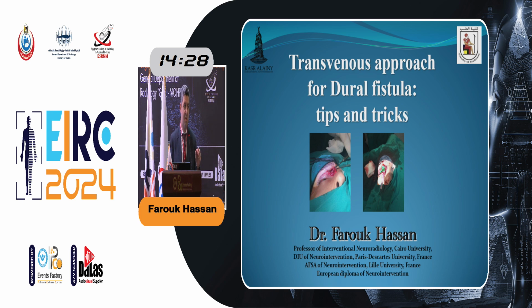We will be talking about the transvenous approach for dural fistula. We'll be talking about some tips and tricks related specifically to the usage of coils with Onyx. We make a pack with coils and then we inject Onyx inside.